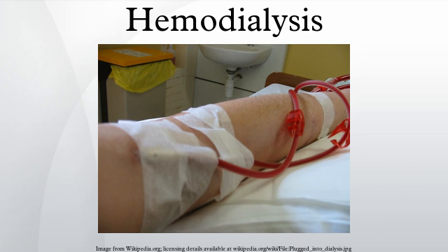Non-tunneled catheter access is for short-term access, and the catheter emerges from the skin at the site of entry into the vein. Tunneled catheter access involves a longer catheter, which is tunneled under the skin from the point of insertion in the vein to an exit site some distance away. It is usually placed in the internal jugular vein in the neck and the exit site is usually on the chest wall. The tunnel acts as a barrier to invading microbes, and as such, tunneled catheters are designed for short to medium-term access, because infection is still a frequent problem.